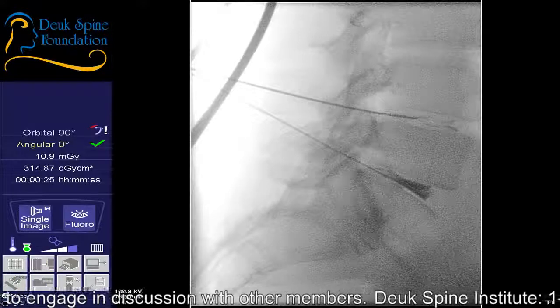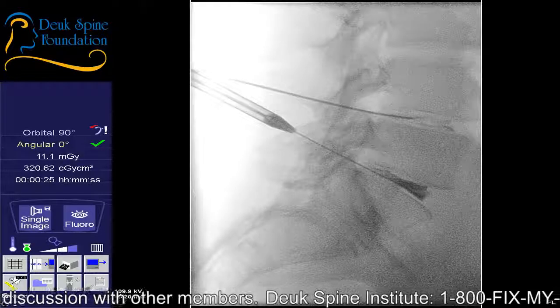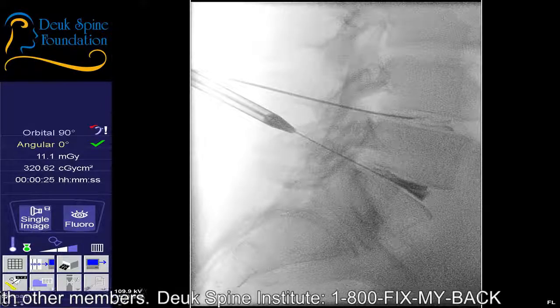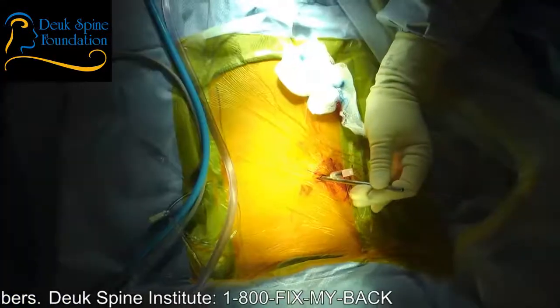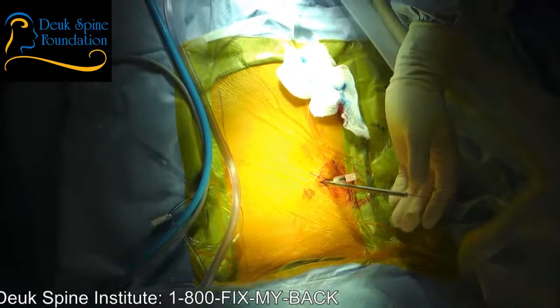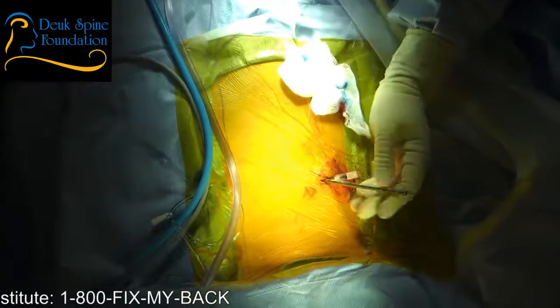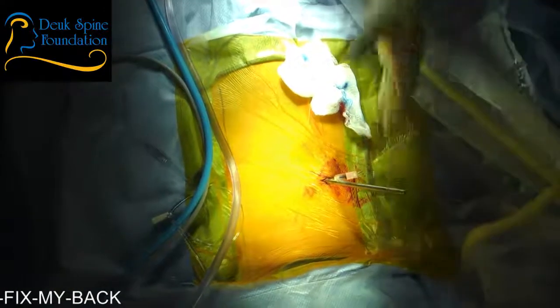Shot? So I'm going to... I couldn't hear you. Would you like us to add short pedicles? Yeah, yeah. So I'm right at the facets now, passing them. I'm in the foramen, and I'm at the disc herniation. I can feel it right there. He's not happy about that. He's feeling it.